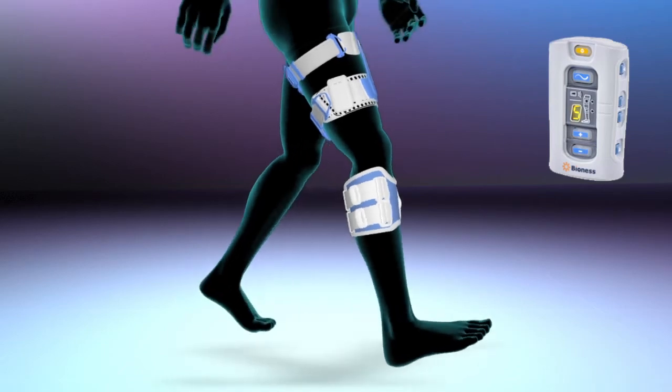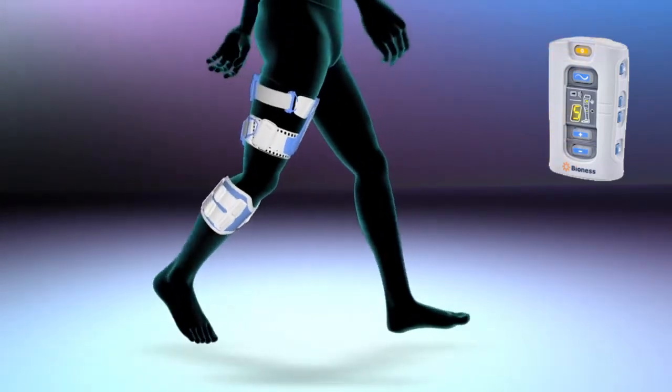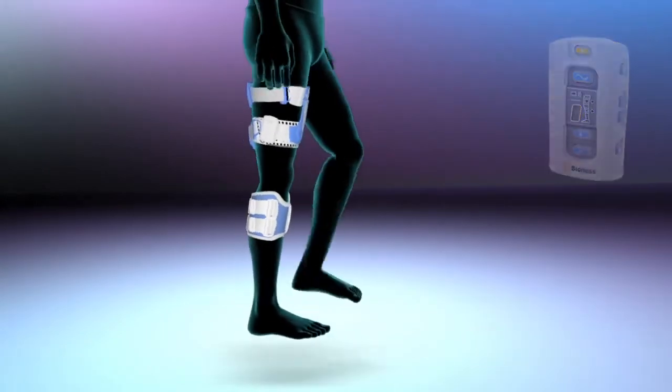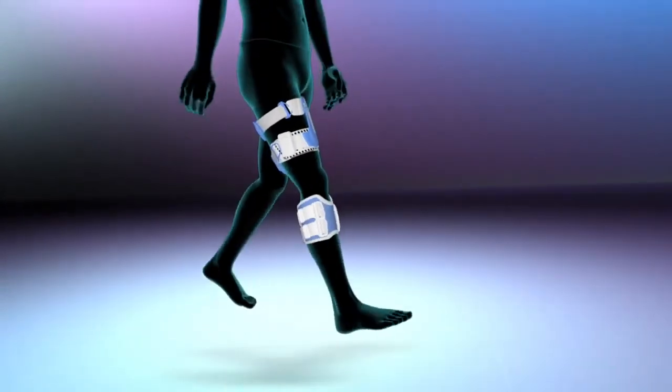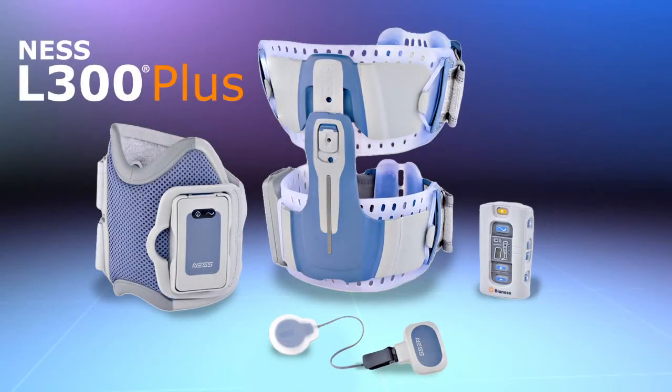The wireless control unit allows simple operation while displaying real-time information regarding the system's status. Get in step with the latest breakthrough in gait rehabilitation. Enjoy the freedom of walking more naturally with the Ness L300 Plus system.